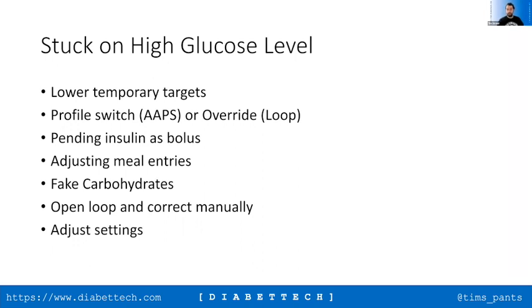So it's all about looking at patterns, understanding the patterns, and then being able to react to those. And if you're having problems with those, asking for help in the groups to see if anybody can give you some advice. Is there anything that anybody wants to add to that? Depending on your insulin, I would be tempted to change my pump set and get a new vial out of the fridge. Yep, that's another thing that may be an issue, yes. That's a very good point.